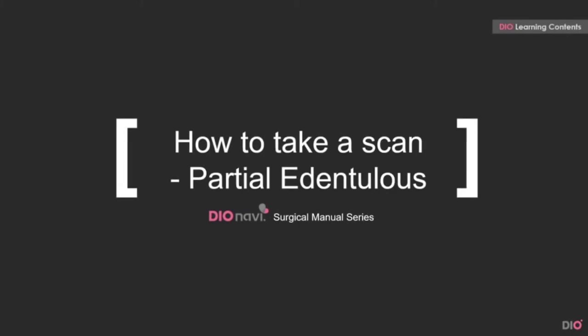Hi, this is Dio. This is the fifth lecture of the Dio Navi Surgical Manual series, How to Take a Scan of a Partial Edentulous Case. Let's start.